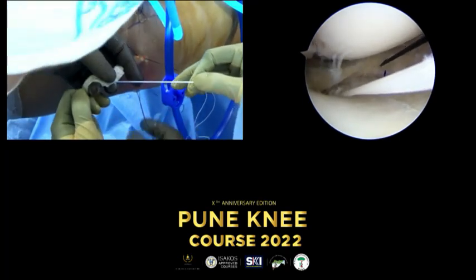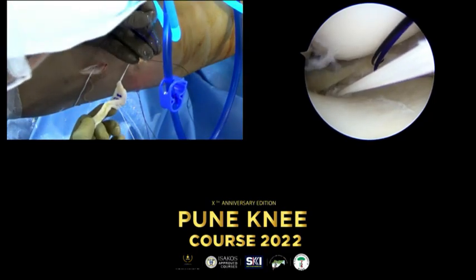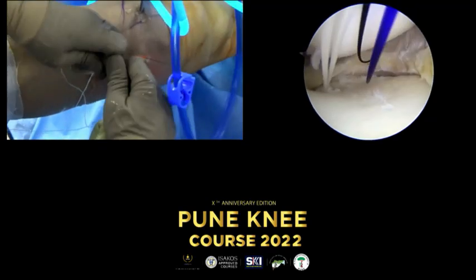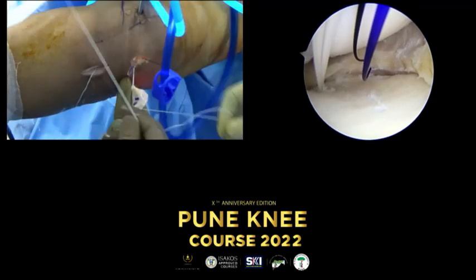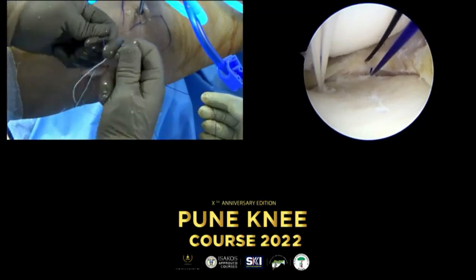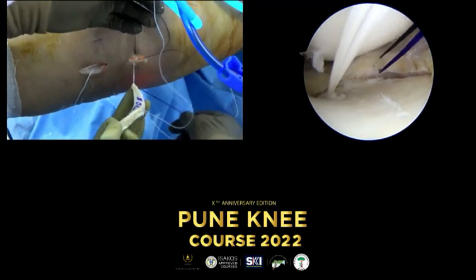So these are two sutures that you've taken at the junction of the posterior third and the mid third. Exactly. And these are going to be railroaded through your portal, and you will use them as a reduction suture to sit your graft at the exact position. It is not mandatory, to be honest, but it helps you to introduce the graft, and also it's a very strong fixation. So for both reasons, we do it. Some people don't do it. I think this is really useful because getting the graft at the correct cranial caudal level is critical, and this ensures that it sits in that exact level.